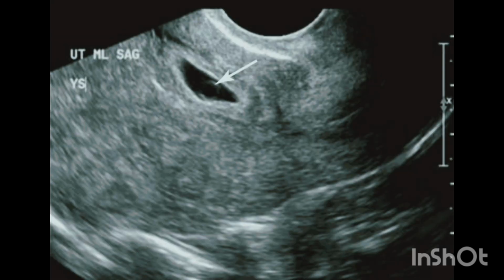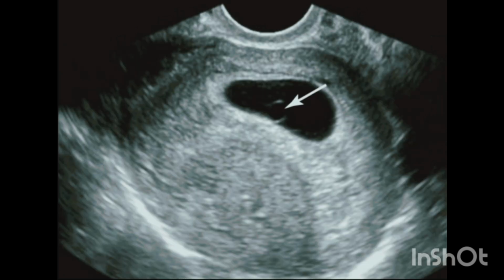This image shows a gestational sac with a yolk sac indicated by the arrow. On follow-up scan after 12 days, you can see an embryo has still not developed and only a yolk sac is present. So this is also termed as a failed pregnancy.